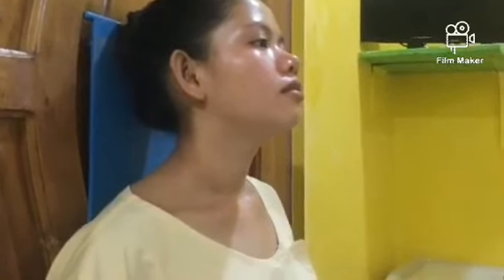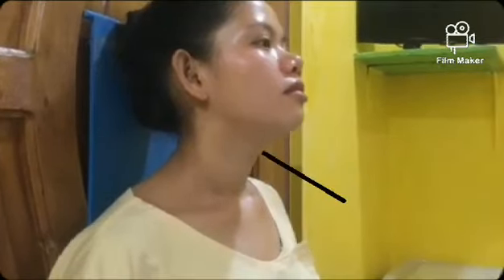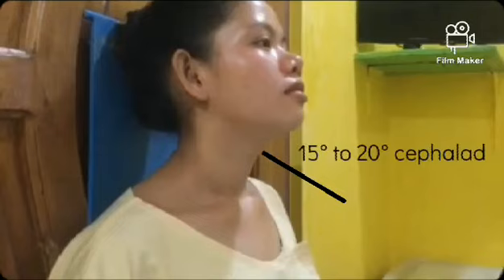So adjust the position of the cassette so that the center of the cassette will coincide with the central ray, and the respiration is suspended for the exposure. As for the central ray, direct the central ray through the fourth cervical body at an angle of 15 to 20 degrees cephalad, so it enters at or slightly inferior to the most prominent point of the thyroid cartilage.